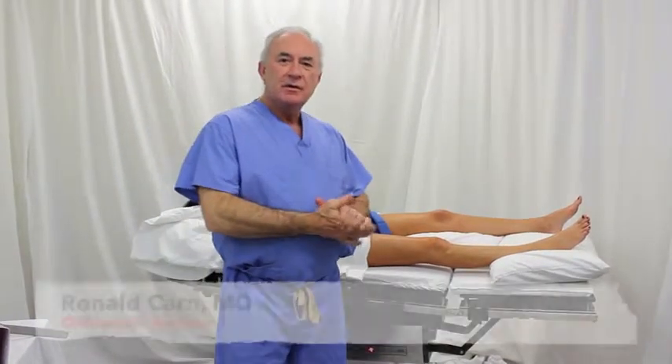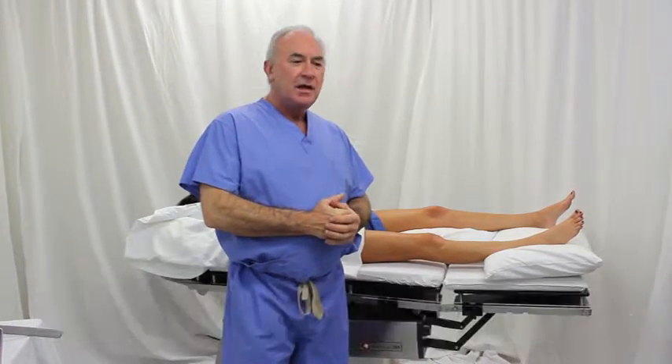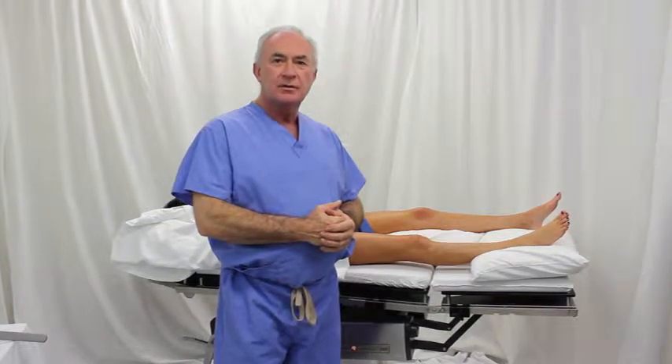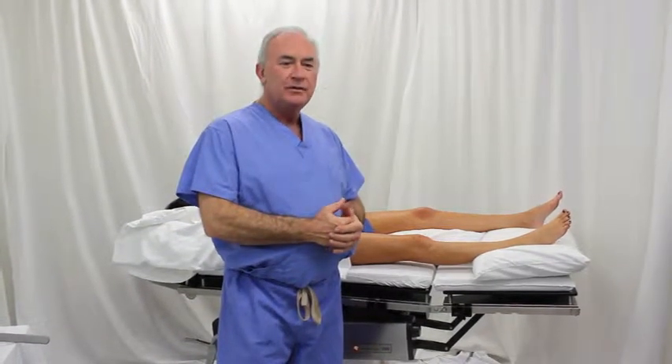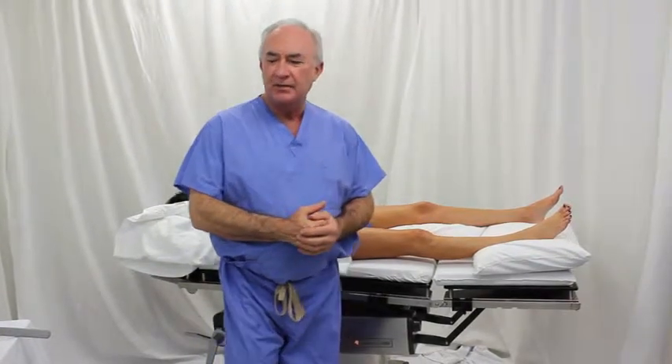Hi, I am Dr. Karn. I'm an orthopedic surgeon and we are going to demonstrate the use of a leg holding device for knee replacement surgery. It is called the knee grip matrix.